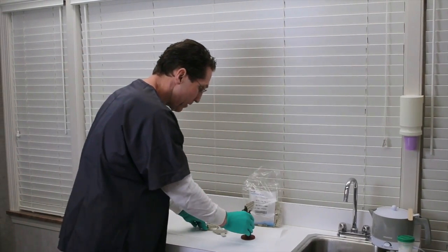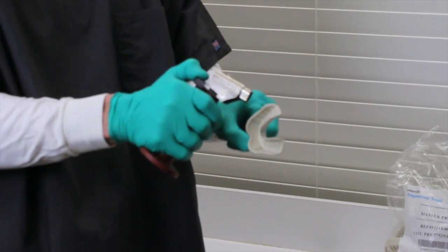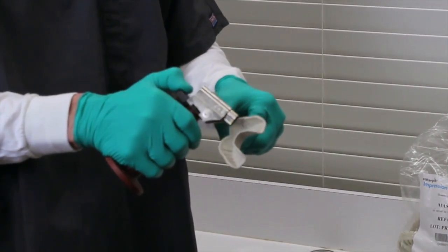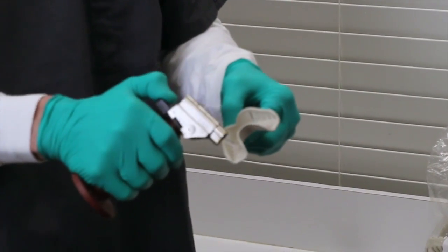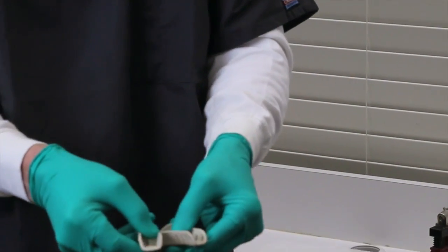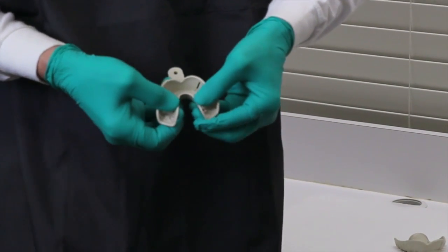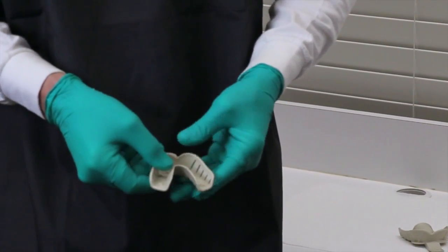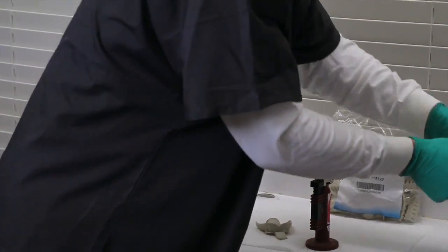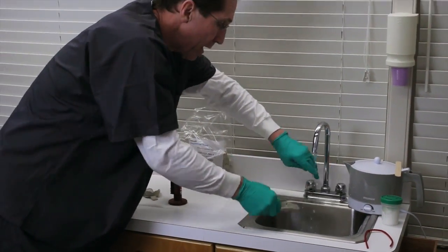Now in the lower, very similar. We're going to heat the labial, but in this case we're going to heat both the facial portion and the lingual. And what I'm doing here on this tray, we'll probably actually end up using these exact trays on our demonstration patient. So we'll heat those peripheries, and we'll typically widen, bring the labial portion forward, and then I'll also bring the lingual portion, you can see that, like that. So that's typically how I modify that tray. And then once again, once it's modified, we'll run under cool water. And there we'll have it.